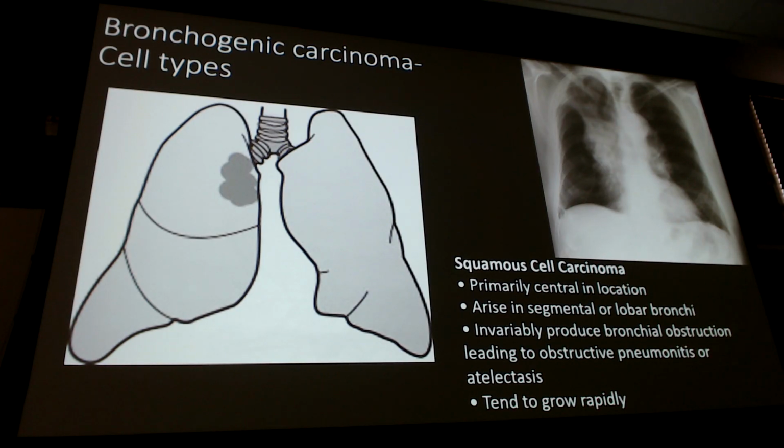So, if I have a patient who is having hemoptysis, right? Maybe not all three symptoms, let's say hemoptysis, and maybe some weight loss, or even just the hemoptysis, right? And I give you this x-ray. We talked about atelectasis, I don't know how to say that plural. Those don't cause hemoptysis, right? So this patient's probably going to have hemoptysis, shortness of breath, maybe a little bit of chest pain. You get this x-ray, they're probably a smoker, right? Maybe older, maybe not, but definitely going to be a smoker.